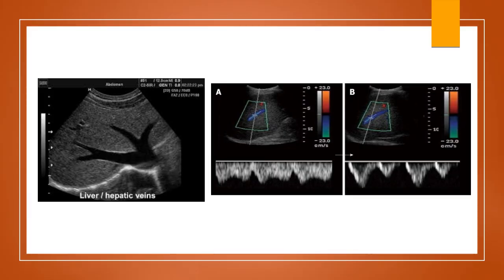Beautiful images. This picture is so nice with the obvious right and the middle and the left that join together prior to emptying into the IVC. And then we can see our pulsatile waveforms with our continuous flow.